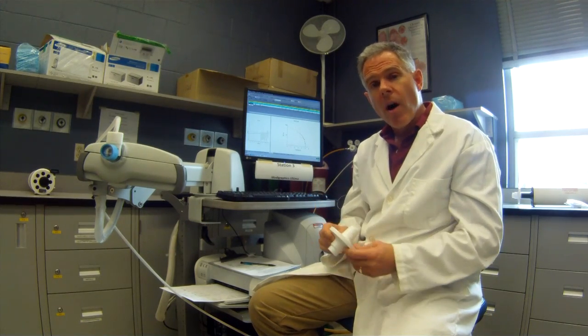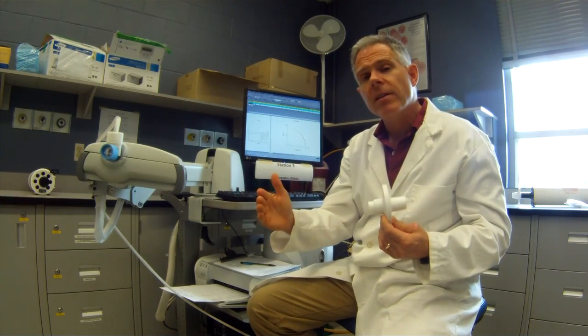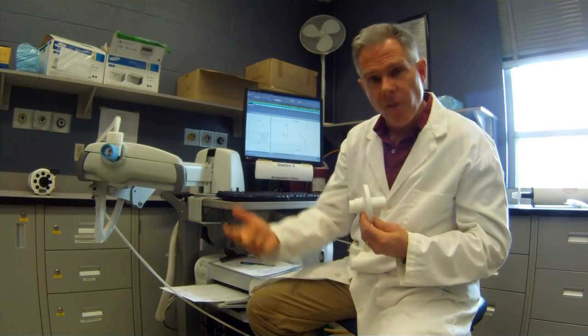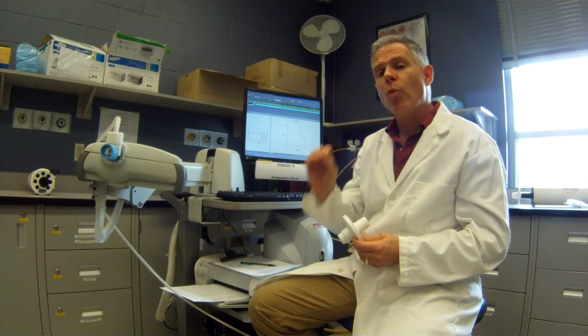So that's for our FRC measurement, or functional residual capacity measurement. And from that, we're also going to be able to determine other lung volumes, okay? So that's a really important measurement we're going to do with nitrogen washout. Thank you very much.